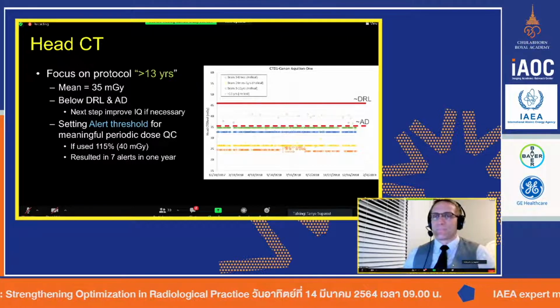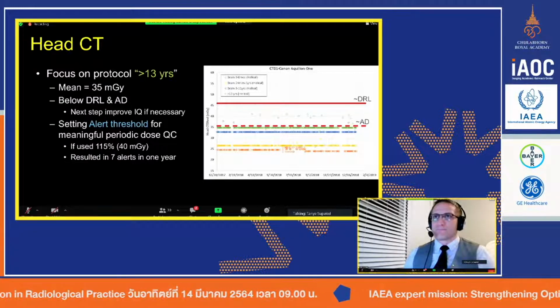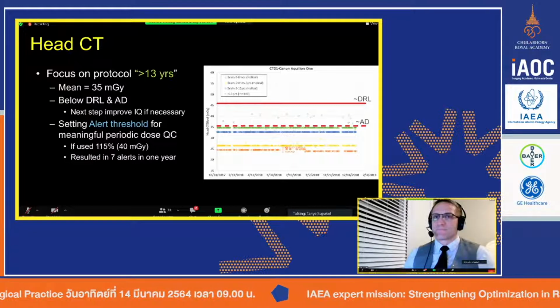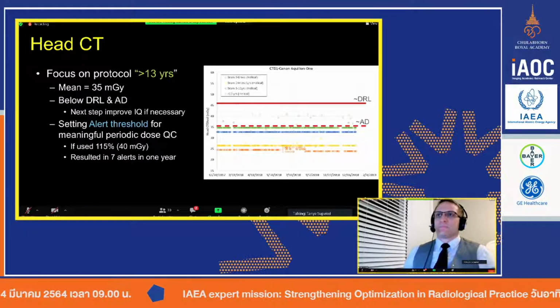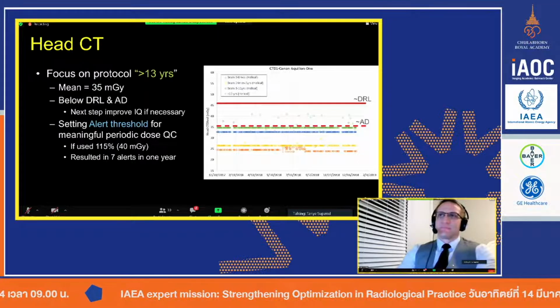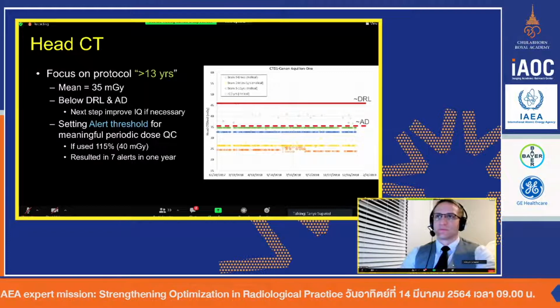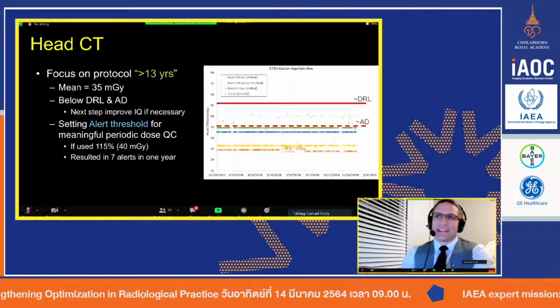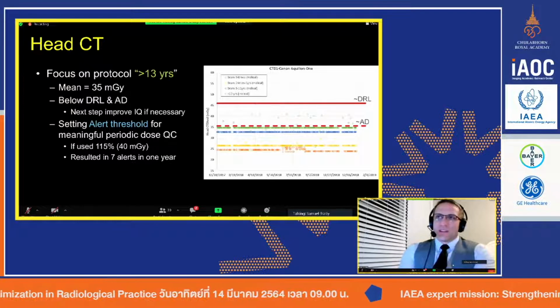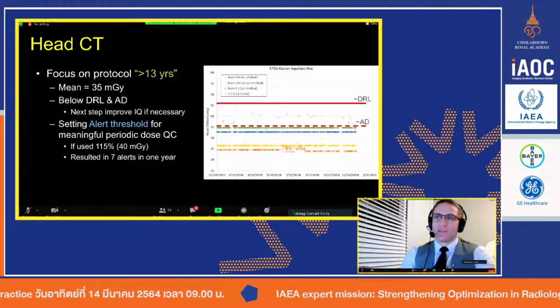So does it mean you recommend at least having two alert levels? One is a really high or dangerous level that needs an immediate alert, like in real time. And the second level, we can review retrospectively, quarterly or something. So the answer is yes. And when it comes to the ones that are really high, you can set an alert level in the Radiometrics.